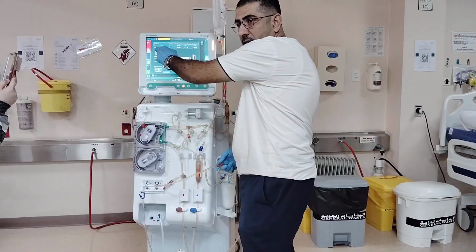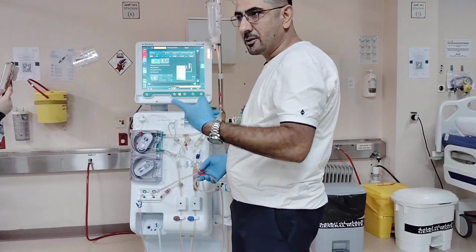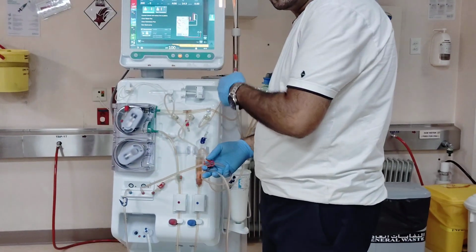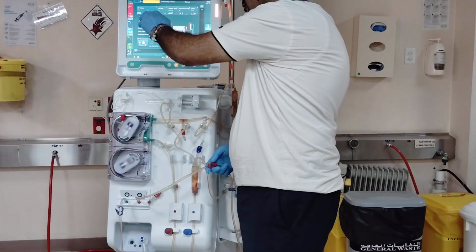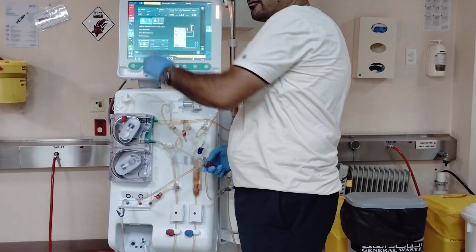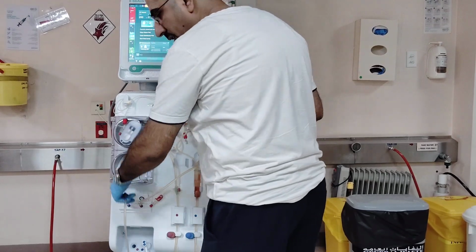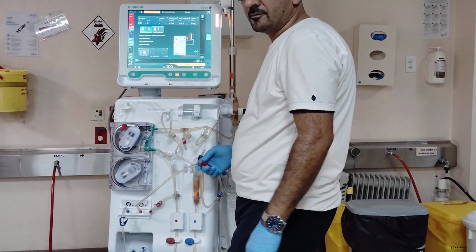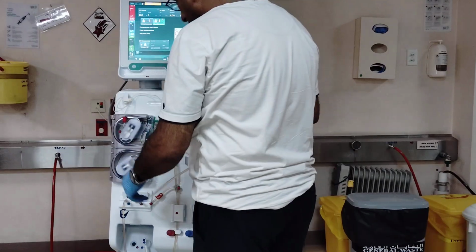For the white connection, I will say the white connection means double connection. I will disconnect both lines and connect here. So please, if you want to do the white connection, you have to choose it from here. Also, you have to change, because if you change the venous and keep this one on the red, it will give you an alarm: this valve is closed. So you have to make sure.